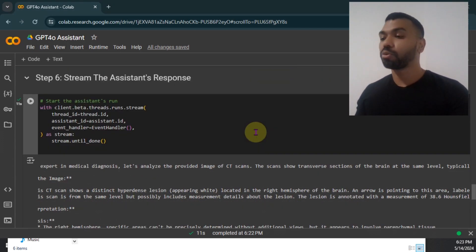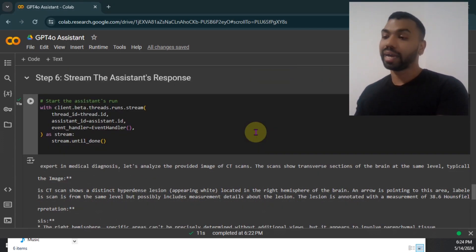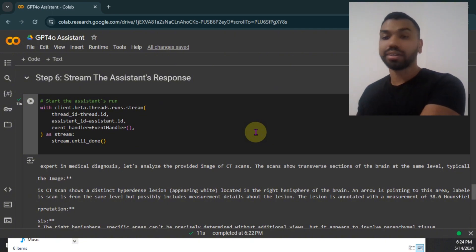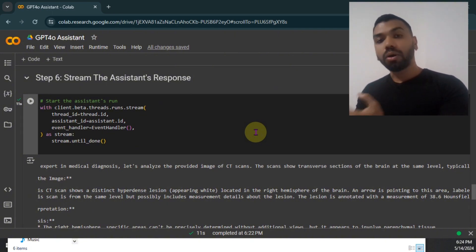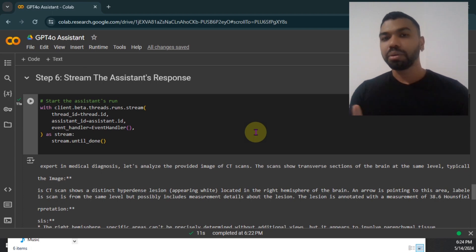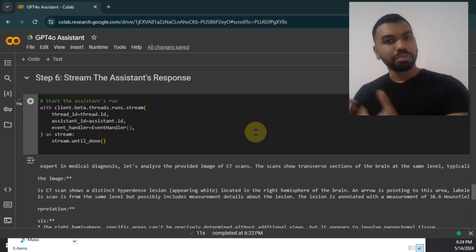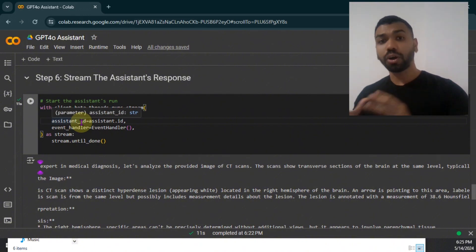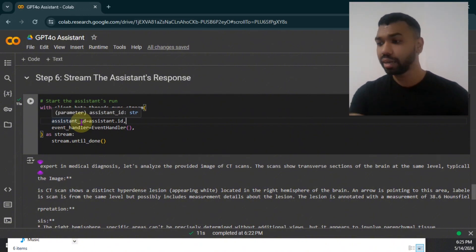The cool thing with the agent framework is that you can now expand this by attaching a knowledge base where it can pull expert medical information. It can also leverage something called threads, which is a collection of messages. Think about this. If you want to make a product with this, you create a seamless user experience where the user comes in, puts in their information and stores all the user's conversation under the thread.